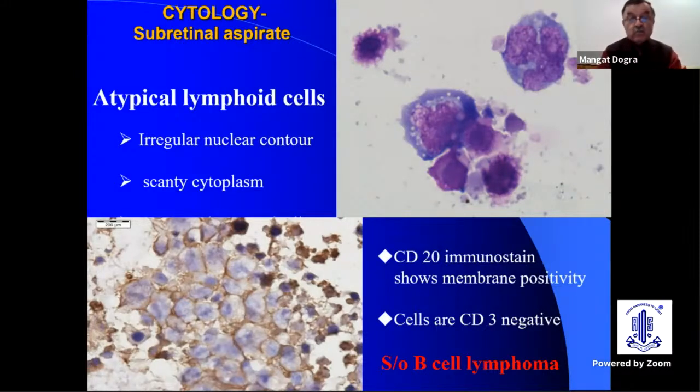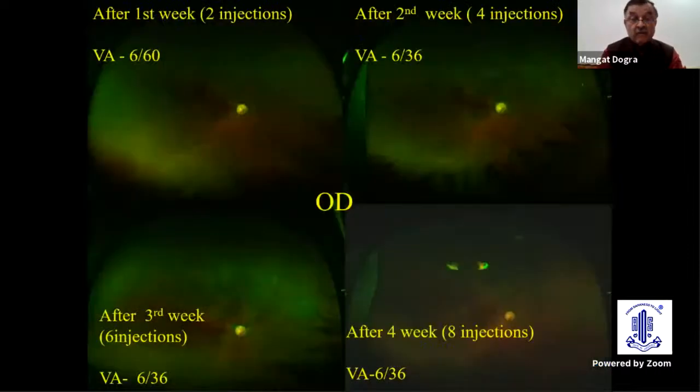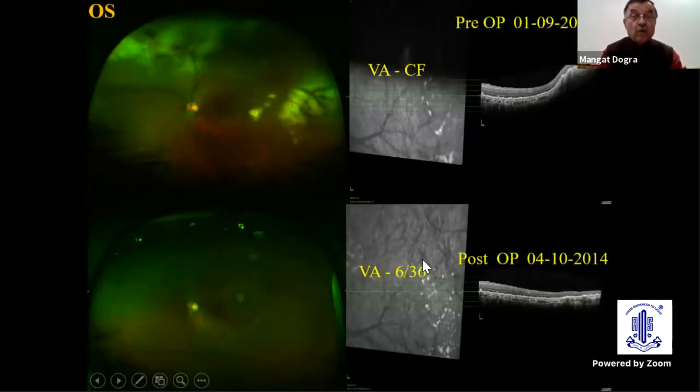This was confirmed as a B-cell lymphoma, and ultimately methotrexate was given first twice weekly, then once a month. A total of 25 injections were given. You can see here a lot of injections were given, and how the whole thing changed after injection. This is the right eye, and even more so the left eye. You can see that vision went from counting fingers to 6/36. And with methotrexate, all those lesions or deposits have disappeared.